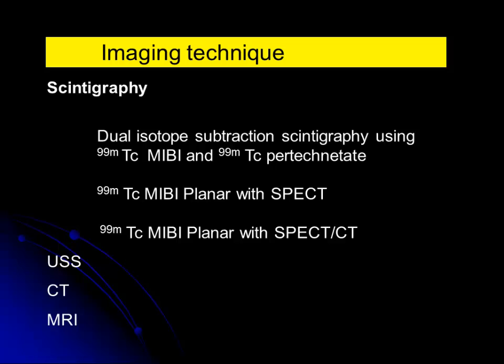In our center, all these patients, if they are suspected of adenomas or overactivity of a gland of unknown site, have an ultrasound initially, and they would have localized or be suspicious of an adenoma. And then they come down to us to localize the site exactly so that they can do minimally invasive surgery.